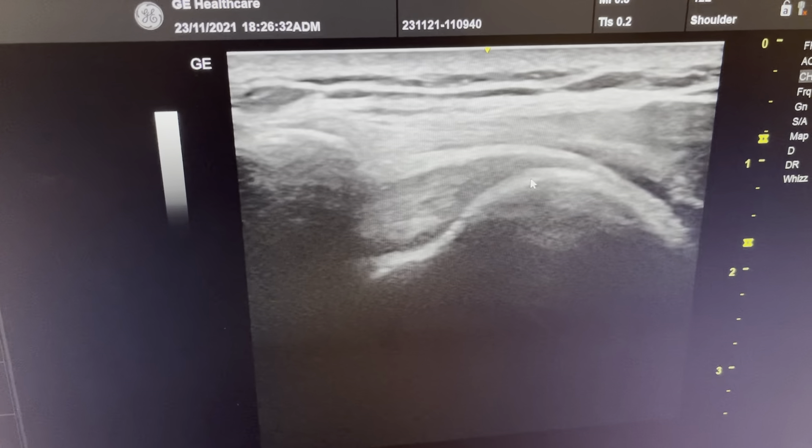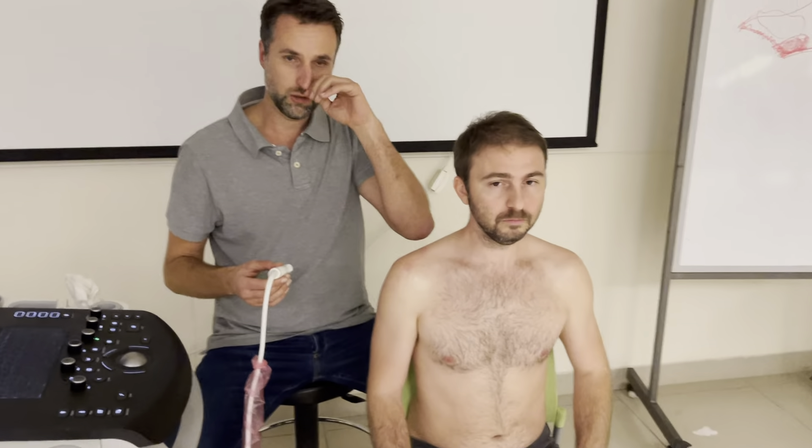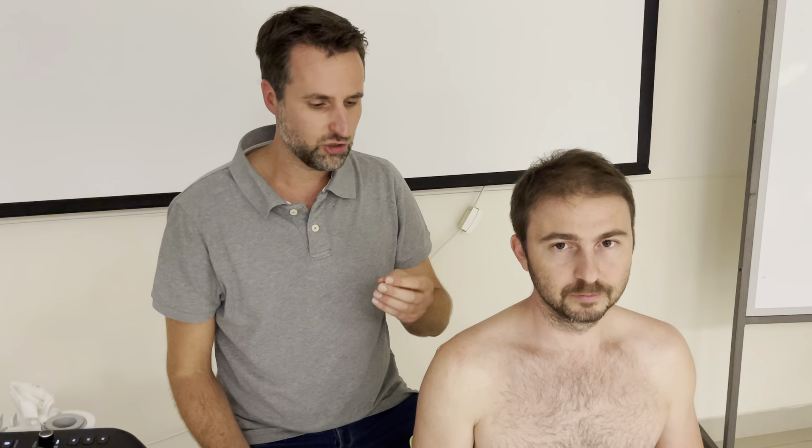We still show this position because it's in all the international protocols. But like I said in the course, when I learned this scan I thought I was going to see all the impingements — all the reasons why people's shoulders would not go up. But I didn't see anything impinging. So in some particular cases you can see, for instance, a very big calcification touching the acromion and the patient says at this point I have my pain — you can have a good correlation. But in most cases, it's not a very useful scan.